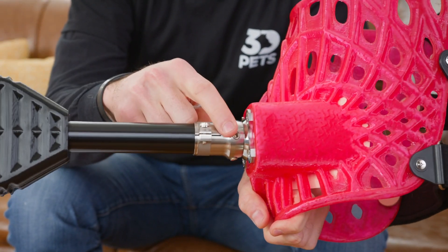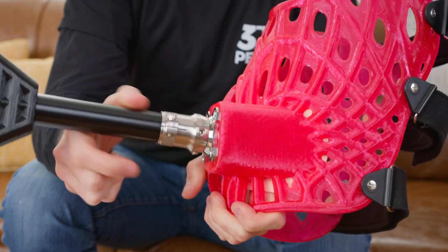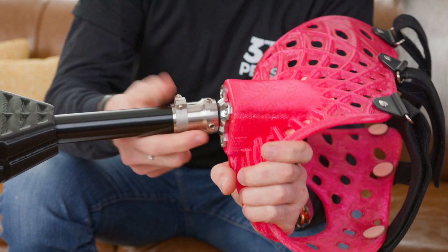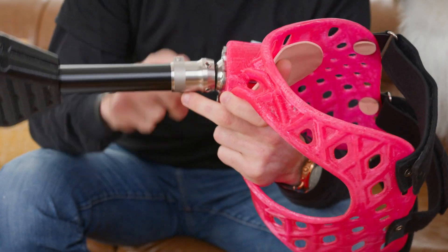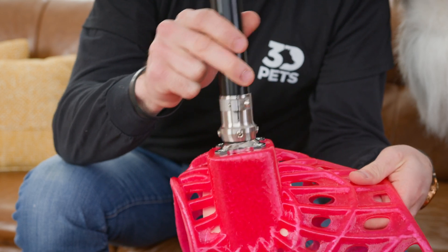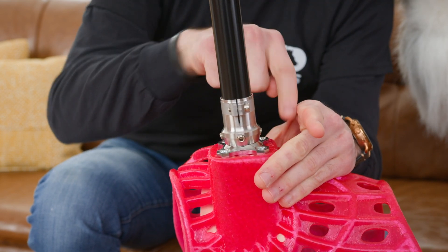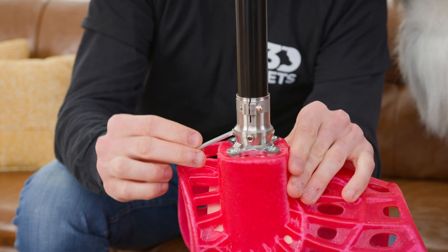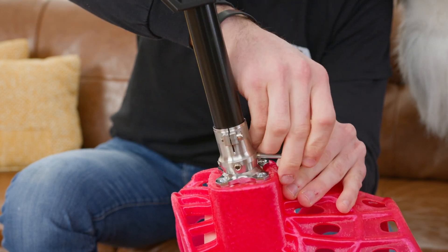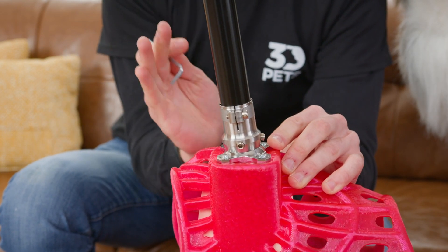We're going to grab this allen key again to make a pitch adjustment. For Sally's device we need to move the leg forward. You're going to start by loosening all four of the allen screws at the top of the adapter by one full turn. You can see that by doing that we essentially loosen the adapter to the pyramid mount, allowing us to move the leg in any direction. We only get about a degree or two of movement forward, back, left, right by doing this, but sometimes that's enough for our fine-tune adjustment. For Sally we're going to need to adjust this leg forward, so we're going to start by tightening the forward most screw until we get towards a point we like and loosen the back most screw, which in turn allows us to move the leg forward a little bit more.